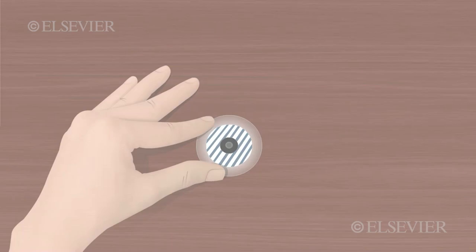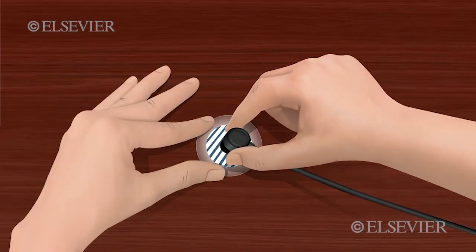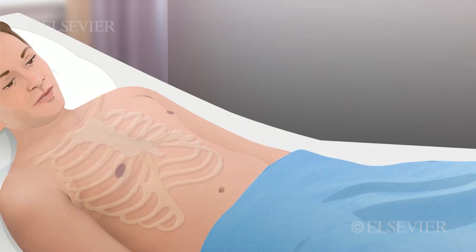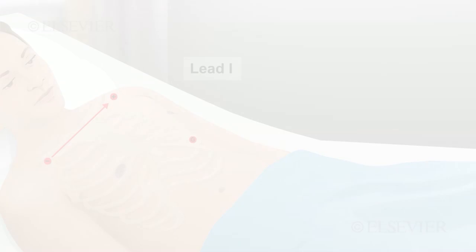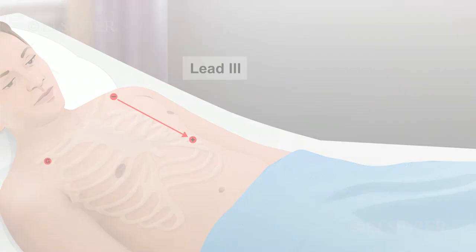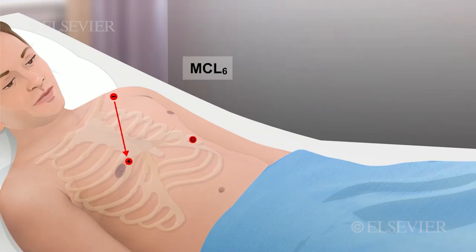Connect the electrodes to the lead wires before placing the electrodes on the patient. When using a 3-lead system, select a lead: Lead 1, Lead 2, Lead 3, MCL1, MCL6.